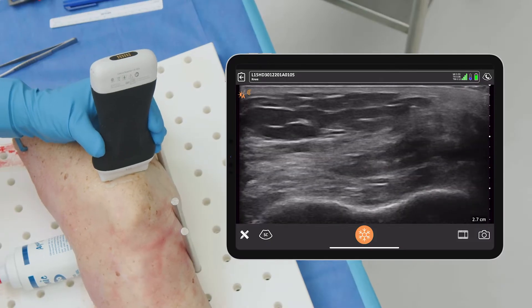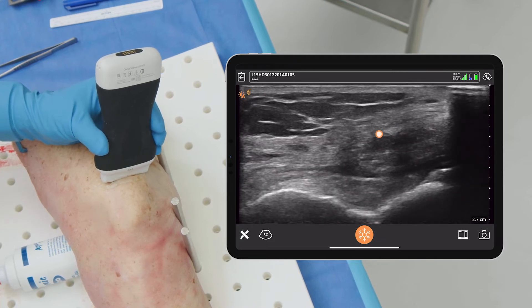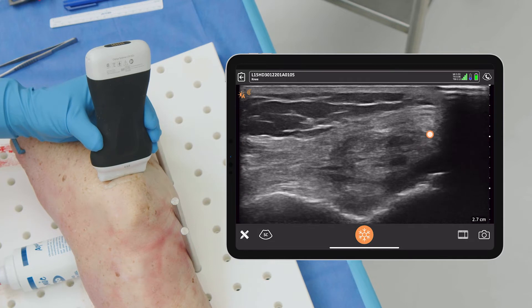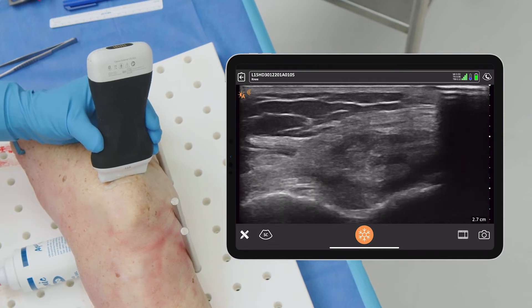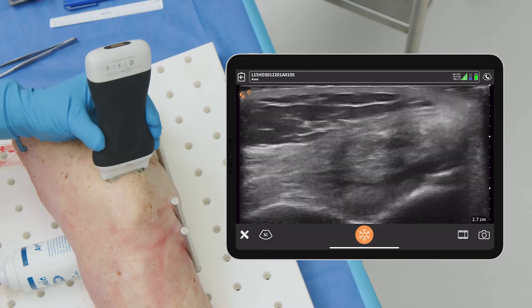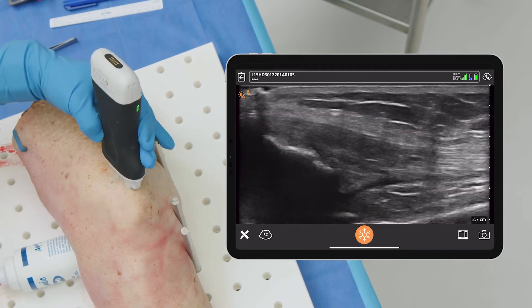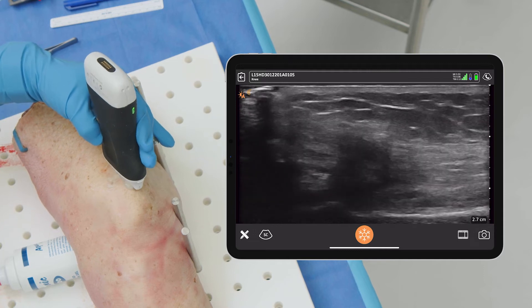It is good and possible to come here. You can see some tendinopathy within that right there. Let me get the optimized image — you can see that the inside of that tendon is not ideal. What's nice about this technique of coming in this way is that it's all in-plane. You can go this way into the tendon and that's fine.